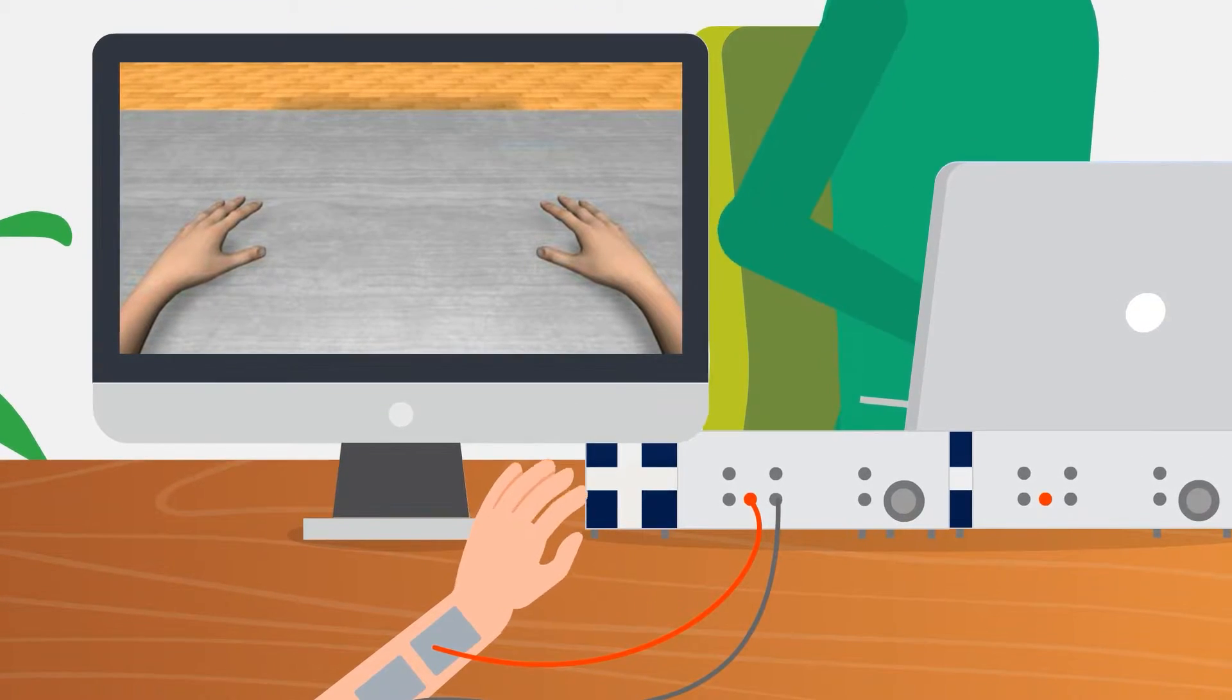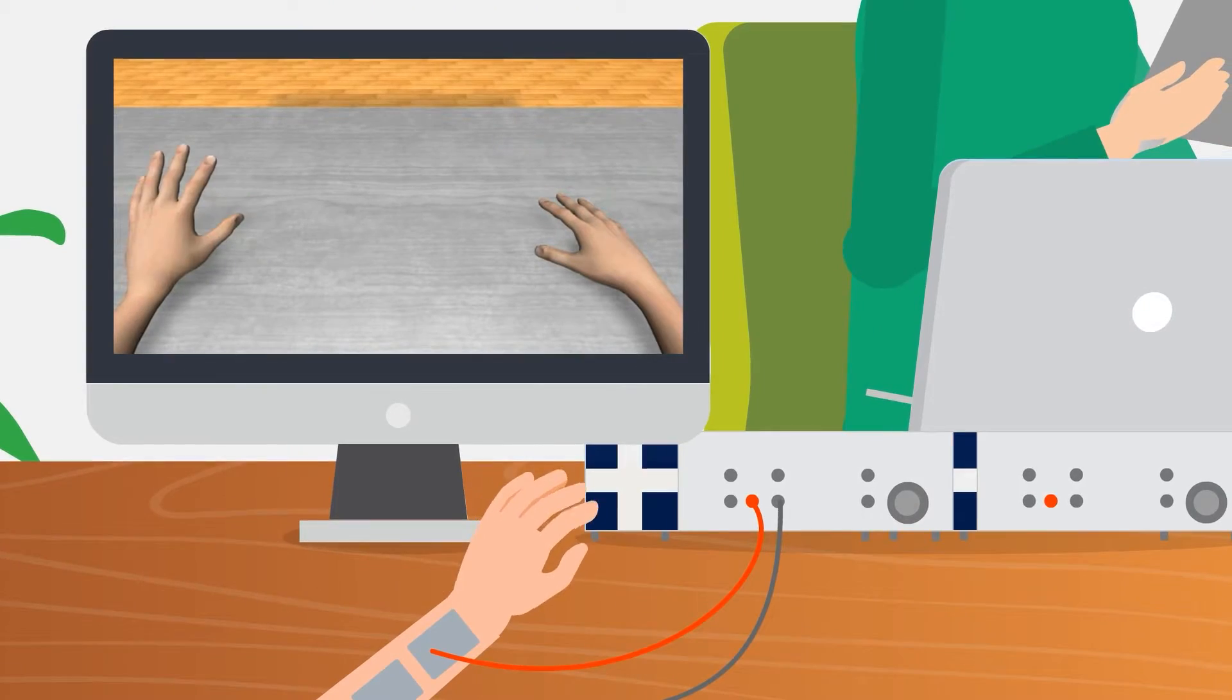At the same time, your impaired muscles are electrically stimulated in real time, resulting in a real hand movement.